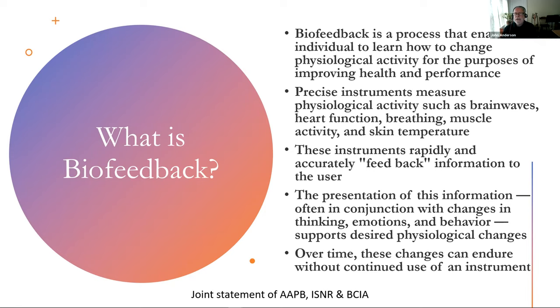Precise instruments measure physiological activity, such as brainwaves, heart function, breathing, muscle activity, skin temperature, and feed back that information to the user. So that's the information. That's the feedback. That's what the client is looking at. They're observing the information. It's a bit like looking in the mirror, and it's a little bit like combing your hair or putting on makeup while you're looking in the mirror, as opposed to not having a mirror and trying to do that without the benefit of being able to see yourself.